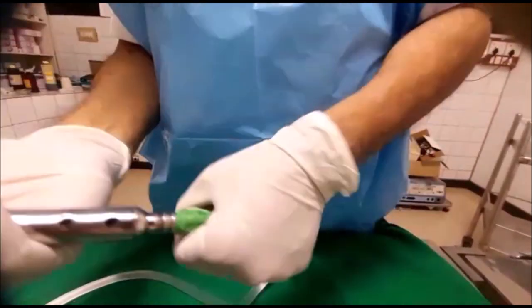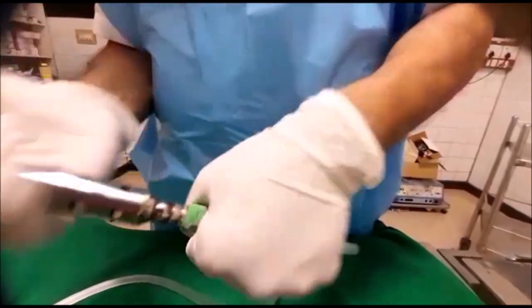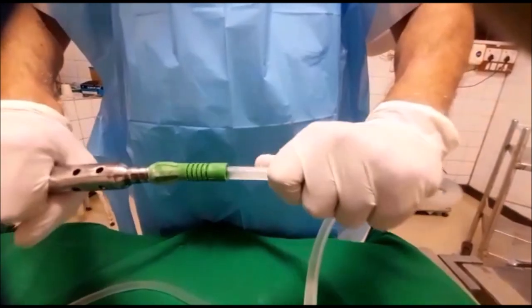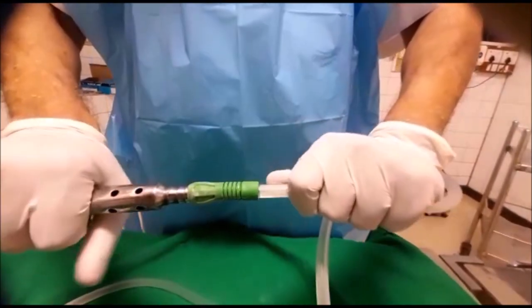You do it this way — it is easy to insert. So now it is fixed. It won't come out. It won't slip during the procedure.